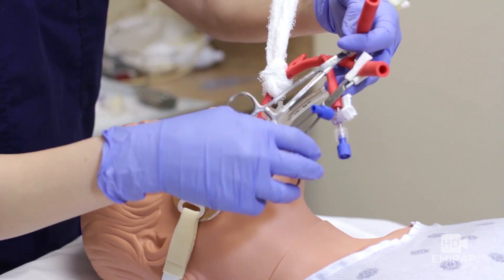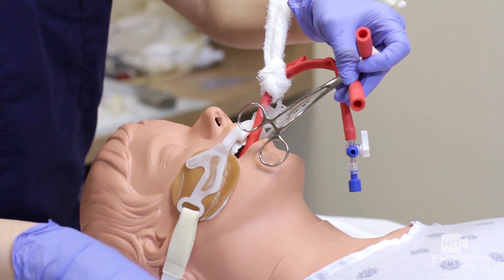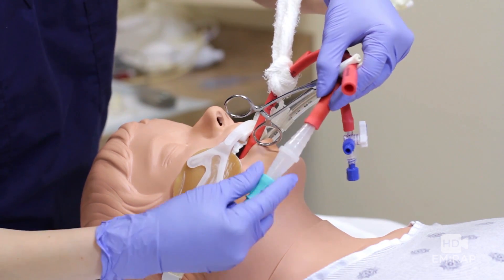Now we're going to hook up wall suction to the gastric and esophageal suction ports. Remove the clamps, use a Christmas tree and suction tubing, and you can suction out all the goombas.